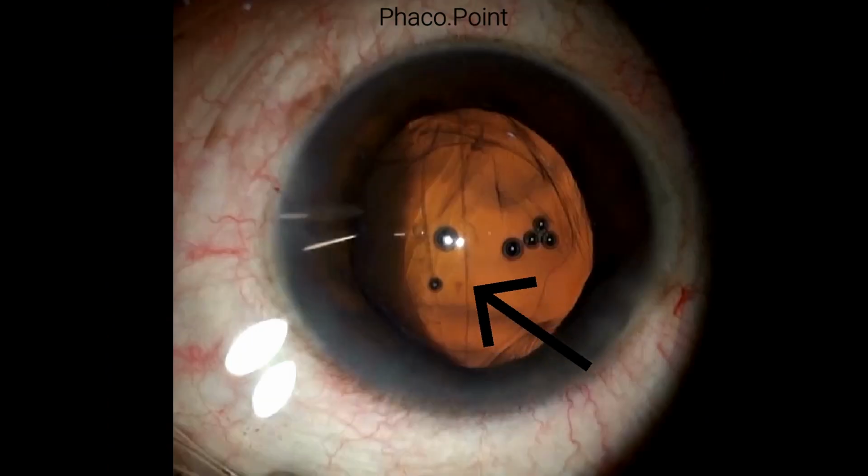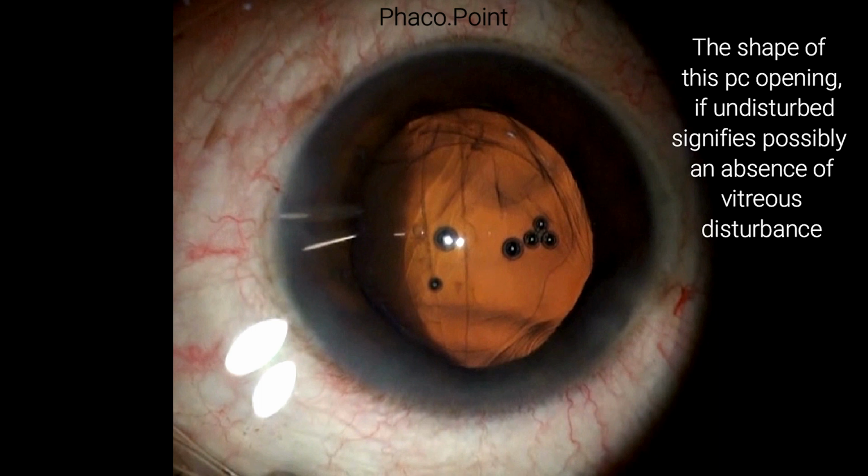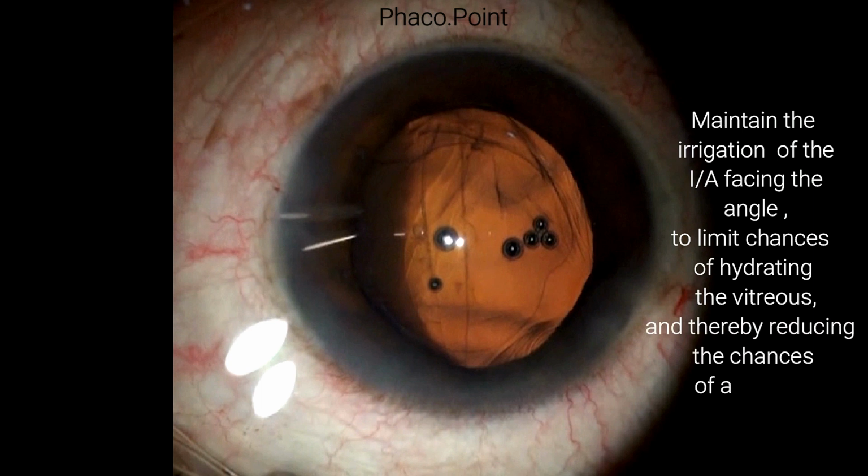equator in these cases. Now, what signifies in these patients that the vitreous is undisturbed is the fact that the shape of this opening in the posterior capsule remains undisturbed. That is, the opening in the posterior capsule remains constant in shape. There is no widening of the opening, which would otherwise signify a vitreous disturbance. Now, should this be the case, you only need to ensure that the irrigation of the irrigation aspiration always faces the angle and not posteriorward, wherein it has a chance of actually hydrating the vitreous, resulting in a vitreous herniation.